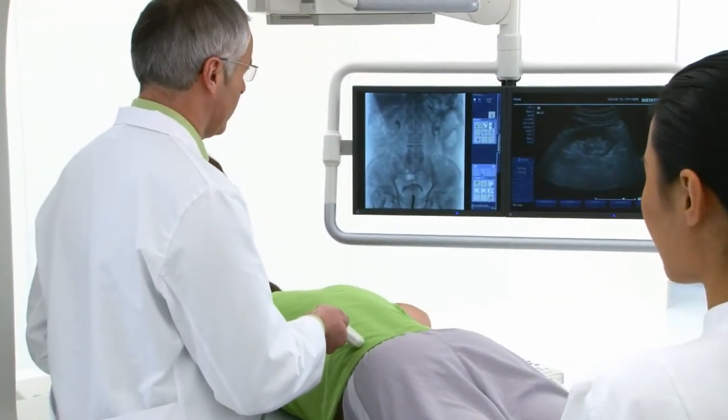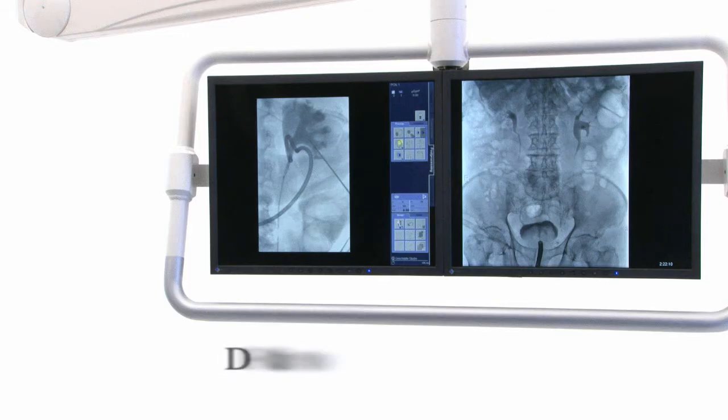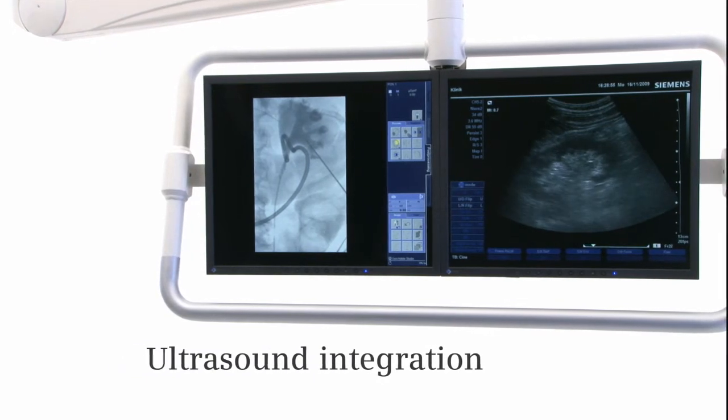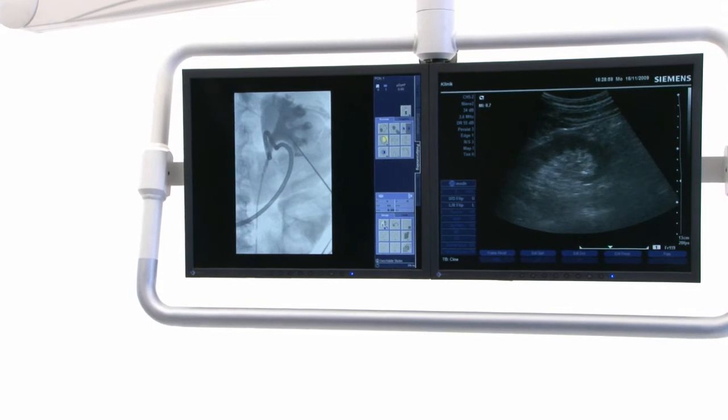The monitors can display images from different modalities side by side — whether live or reference DR, fluoroscopy, HD endoscopy, or ultrasound images — so you have the important information at a glance.